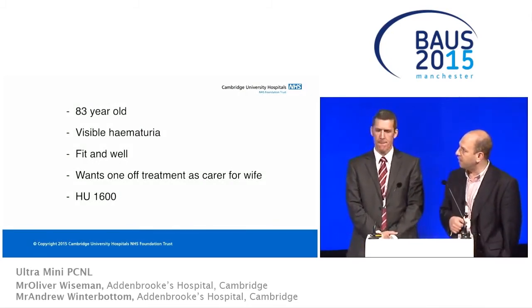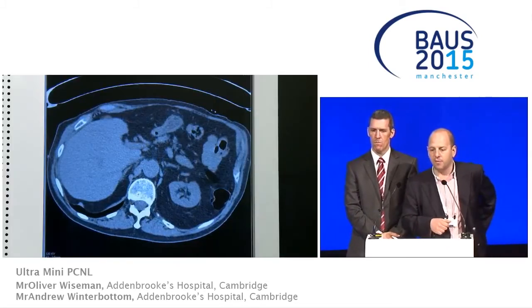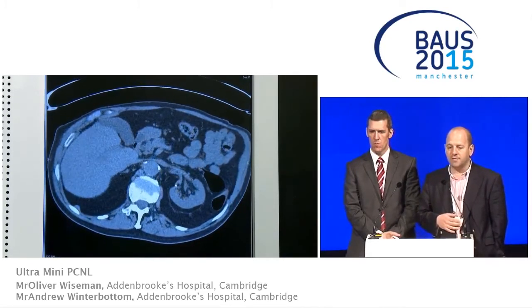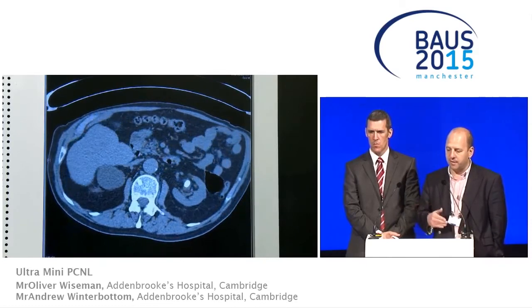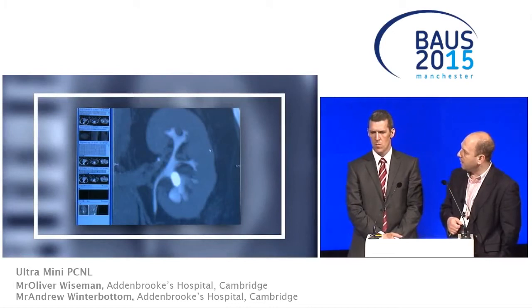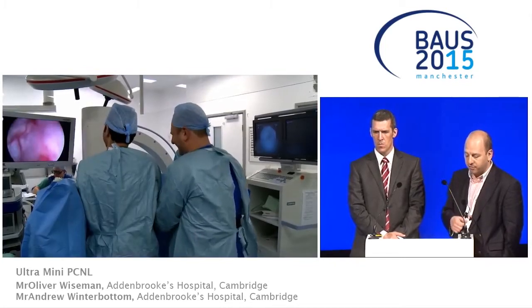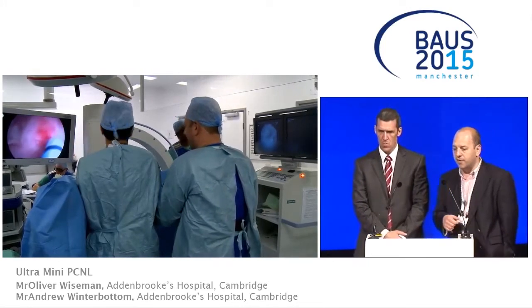This is an 83-year-old man who had visible hematuria, fit and well. He wanted a one-off treatment as a carer for his wife. This is a hard stone in his left kidney, about 17 millimeters, and we discussed the treatment options: lithotripsy, flexible ureteroscopy, and PCNL. If you look at this lie, you can imagine that if you fragment this stone with lithotripsy, some of those fragments may well drop into the lower pole, and you may well have the same issues with flexible ureteroscopy. We start off by putting a retrograde catheter up from below.